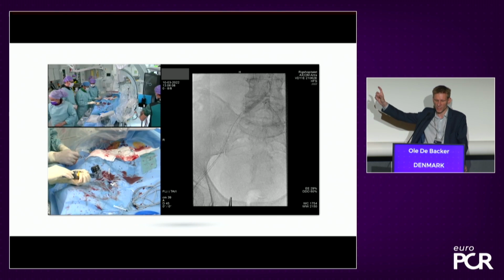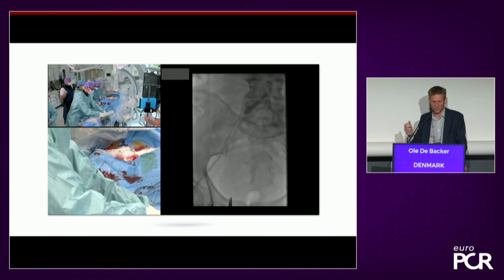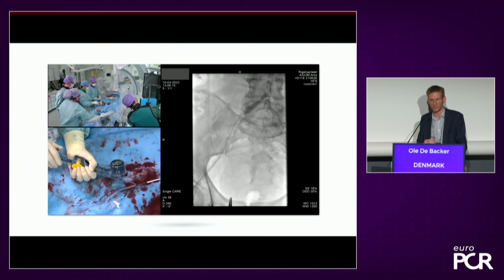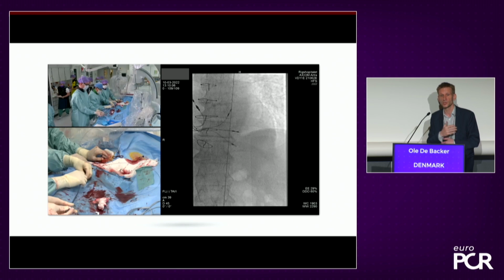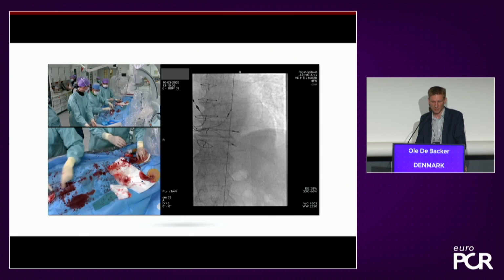So you see, I worked my way down with this. In the meantime, a couple of series. It takes a couple of minutes, of course. It prolongs your procedure by, I would say, 10 to 15 minutes. But the beauty is that you can keep on doing the procedure transfemoral. An alternative access is much more complicated. You lose even much more time there. So it's a limited time loss.